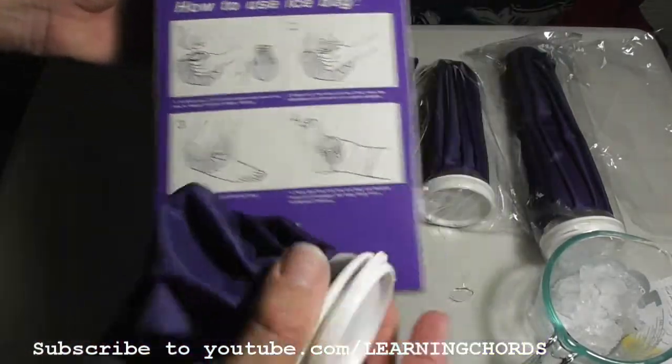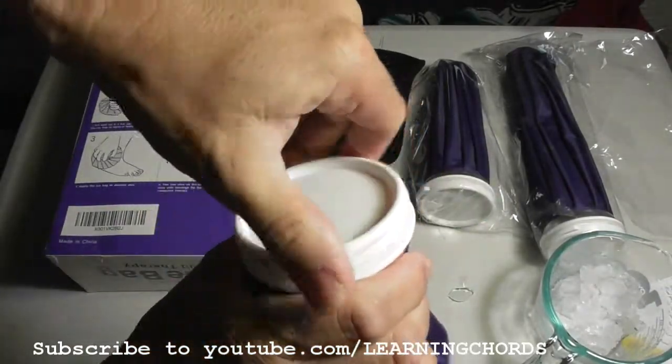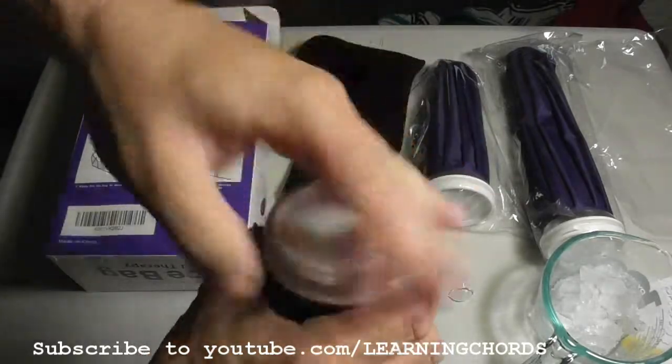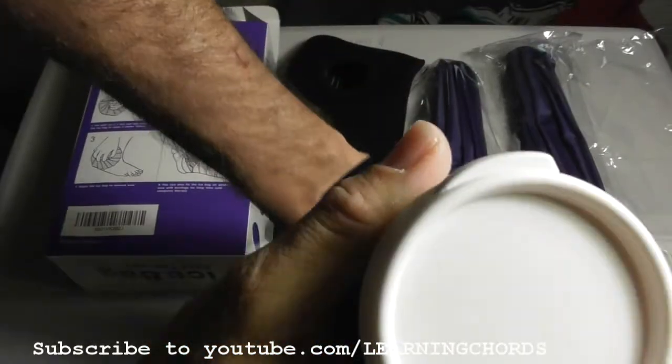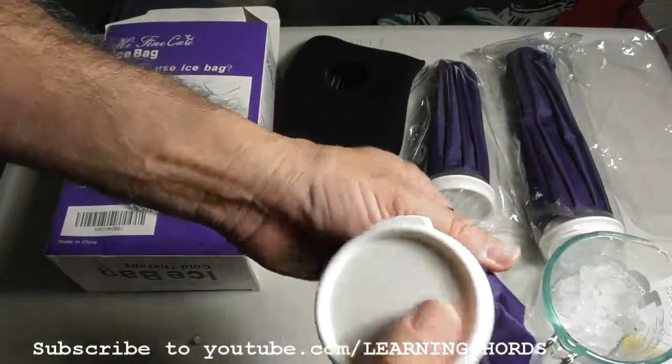You don't even need instructions. All you do is take the leak-proof top off, fill it up with ice, close it, and apply it to a sore part. This just feels so good — it's really just amazing how good ice feels.